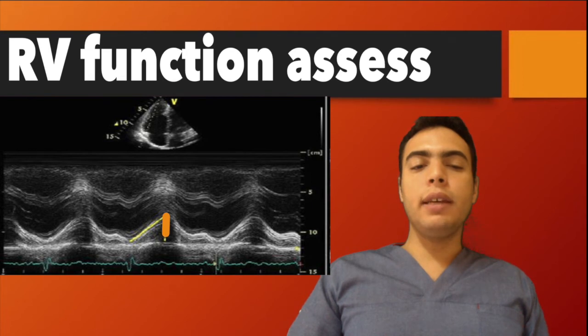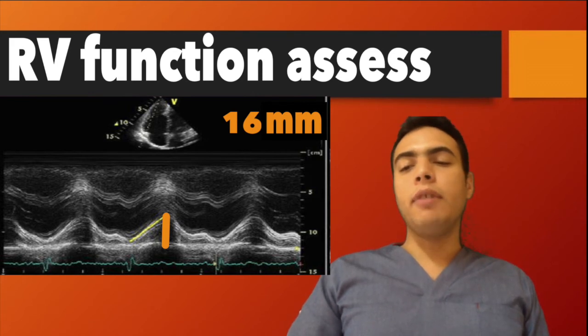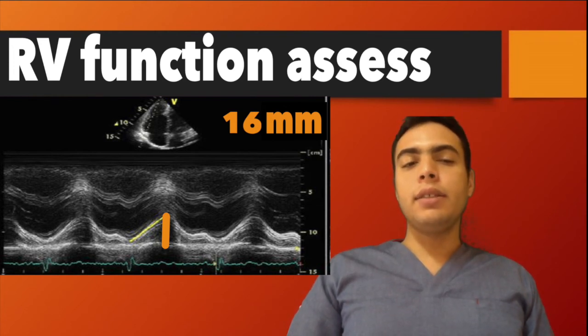As you can see here, the length measured is the longitudinal displacement. It shall be above 16 mm for normal systolic function of the right ventricle. But actually, if we get it below it, it means that there is right ventricular systolic dysfunction.